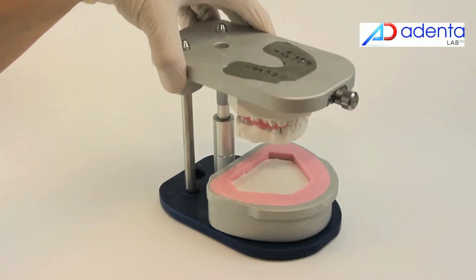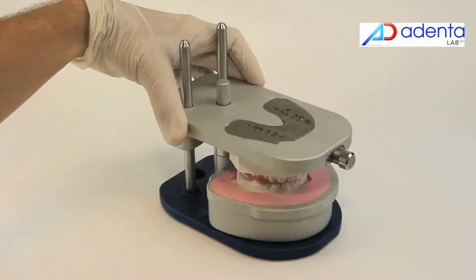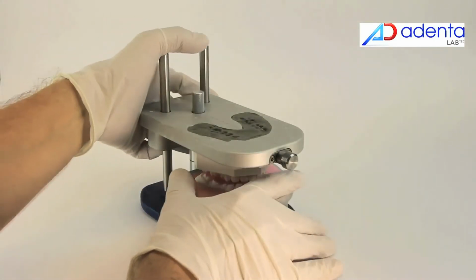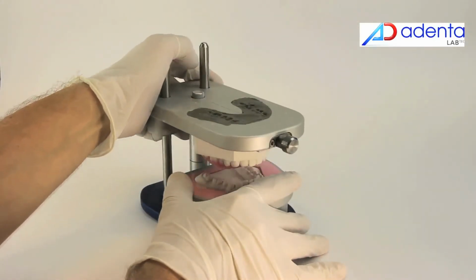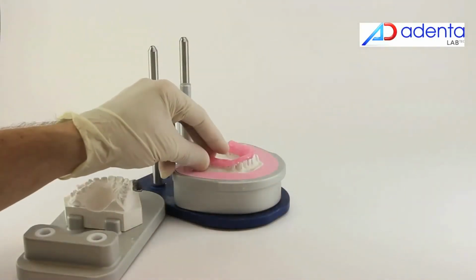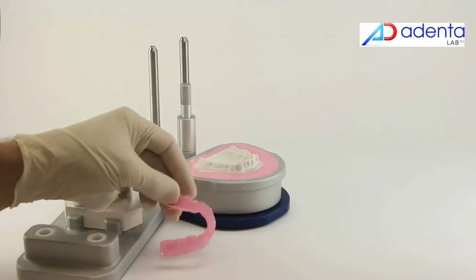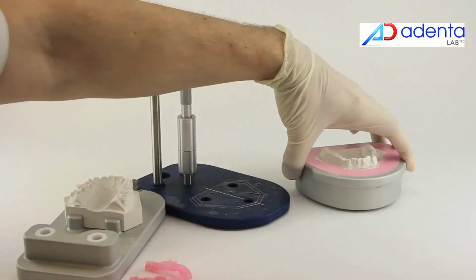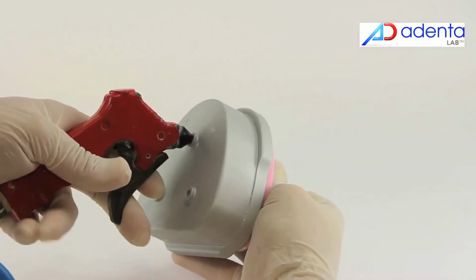The plaster is poured into 4/5 of the lower model and the model is positioned until it hardens. In continuation, the positioning plate is removed together with the upper model and the register. The lower model is removed from the mold.